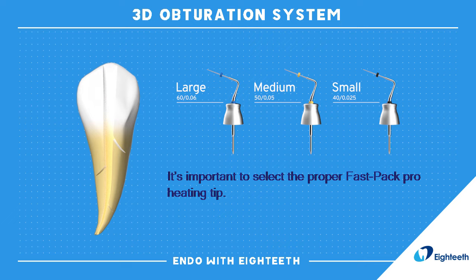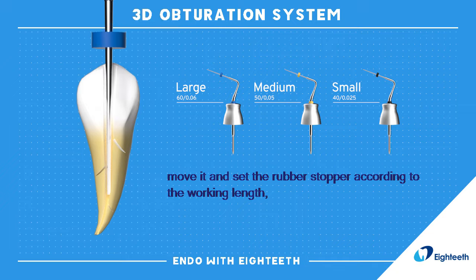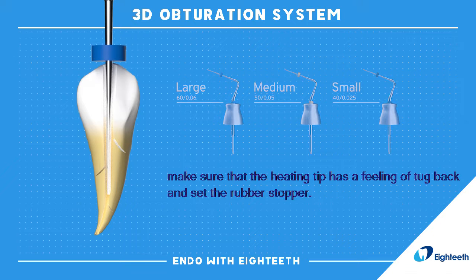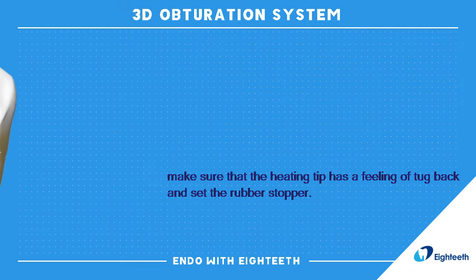It's important to select the proper Fast-Pack Pro heating tip. Once the appropriate heating tip is selected, move it and set the rubber stopper according to the working length. Make sure that the heating tip has a feeling of tug back and set the rubber stopper.